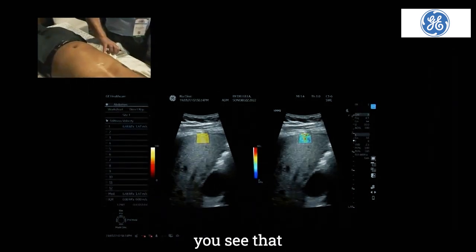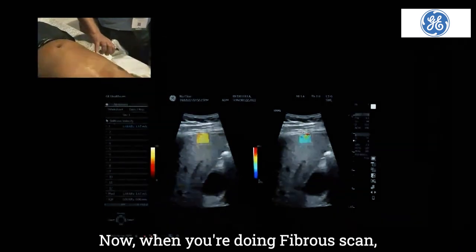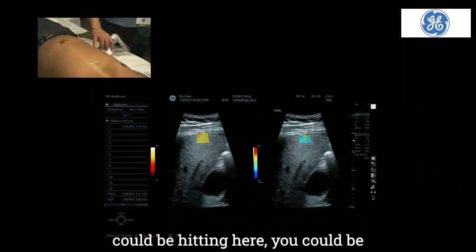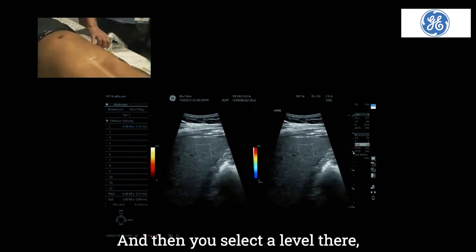You see that from the capsule you're getting reverberation artifact. So this will lead to false positive. Now, when you're doing Fibroscan, you don't know where you're hitting actually. You could be hitting here, you could be hitting here, you could be hitting the gallbladder for all I know. So, and then you select a level there. Breath hold, please.